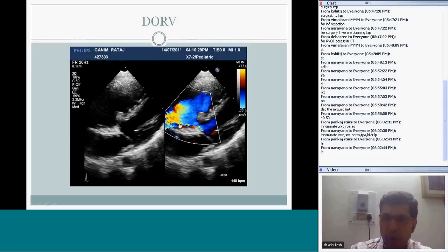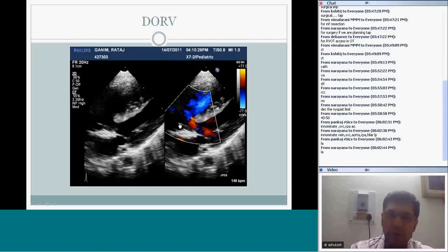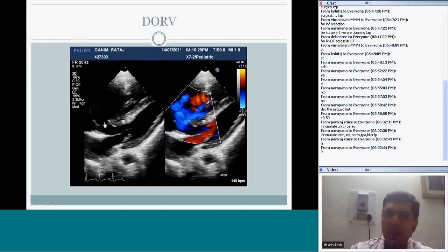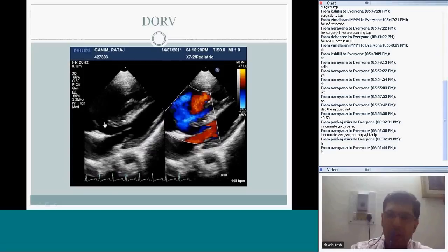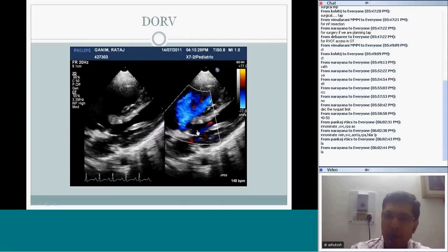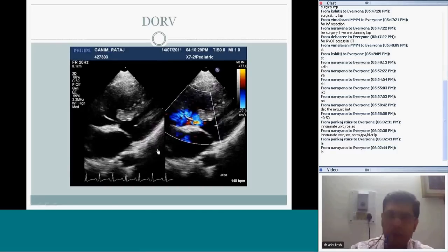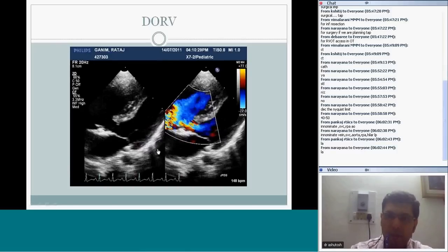So this video helps to sort out some issues. Good aortic override, aorta is definitely into the right ventricle, and there is this muscle here present between the aorta and the mitral valve.